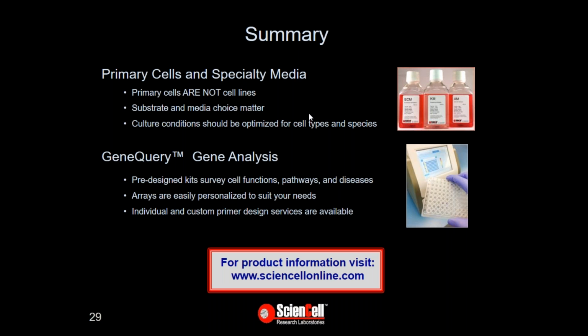So one question was, why is centrifugation more dangerous than DMSO for the cells? It's just really rough on the cells. And the DMSO, it's not great if you leave them in there for too long, but the physical impact of centrifuging... they're kind of groggy when you first wake them up from being frozen.